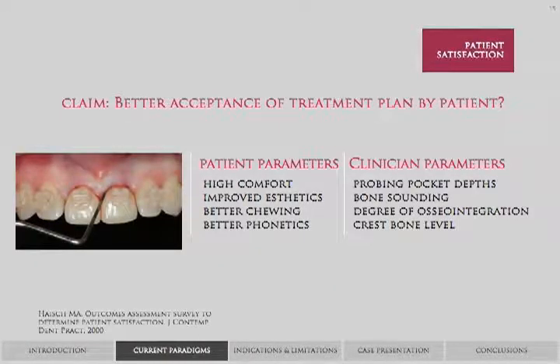So basically, it's all about the patient and clinically what we see. We want to be able to examine the patient really well at the first appointment: sounding the bone, pocket depths, looking at the x-ray, root angulation, tissue thickness, biotype, and seeing where the crestal bone levels are.